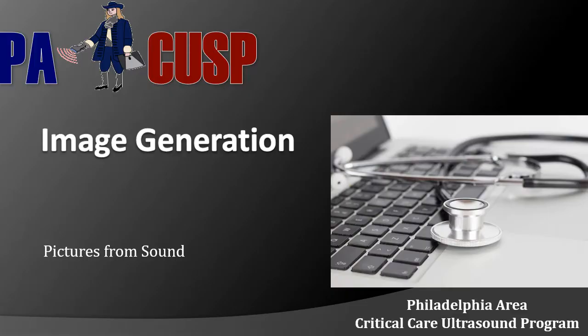So how do we actually generate an image? For those of you that don't have any significant experience with point-of-care ultrasound, it's really nothing more than a stethoscope for the eyes. Loosely translated, sonograph means writing sound. Ultrasound just refers to sound waves above the audible limit of human hearing. So when you put all that together, again, this is nothing more than a stethoscope for the eyes. If you've learned how to master a stethoscope in medical school and residency, learning how to use your eyes for that same sort of application is not a huge leap of faith.